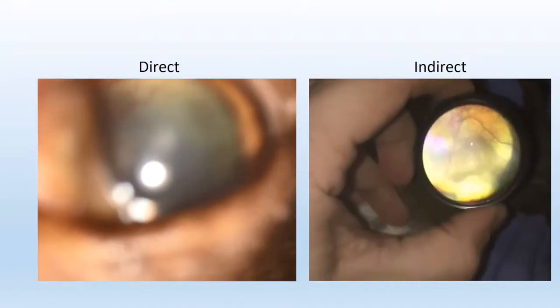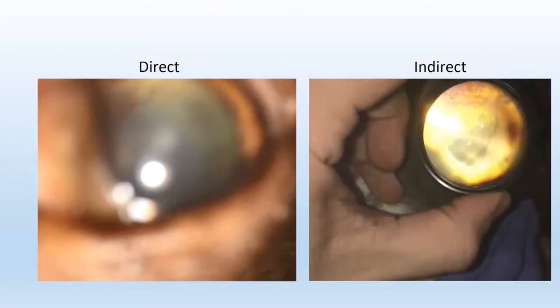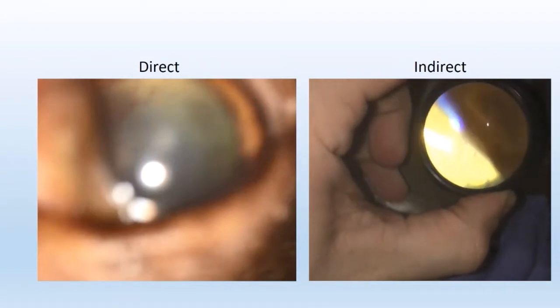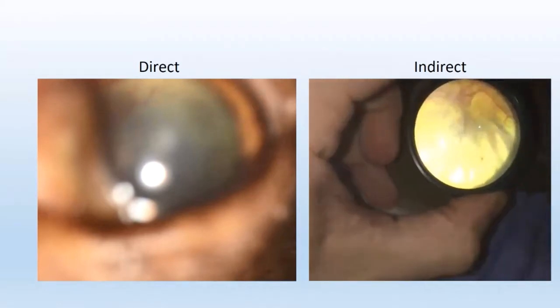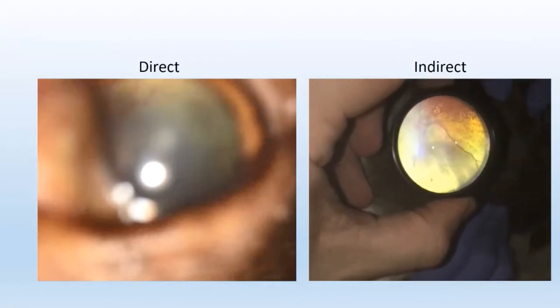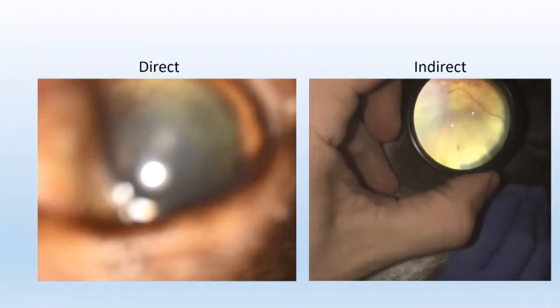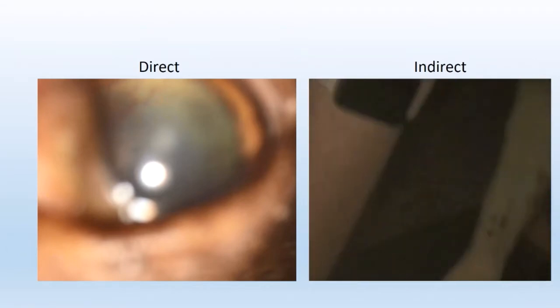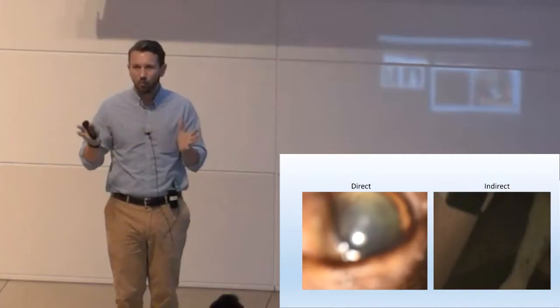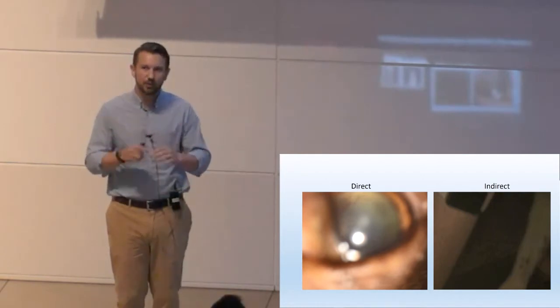It really does help, especially with the bigger phones, if you have someone tapping on the image as you're taking it to adjust the exposure. When you tap on your phone, if you're taking a picture of a portrait or a landscape, we're all familiar with the fact that the phone, before tapping on the screen, gives you kind of a washed out image until you tap on it. It adjusts the exposure. It's really helpful when you work with a tapetum.